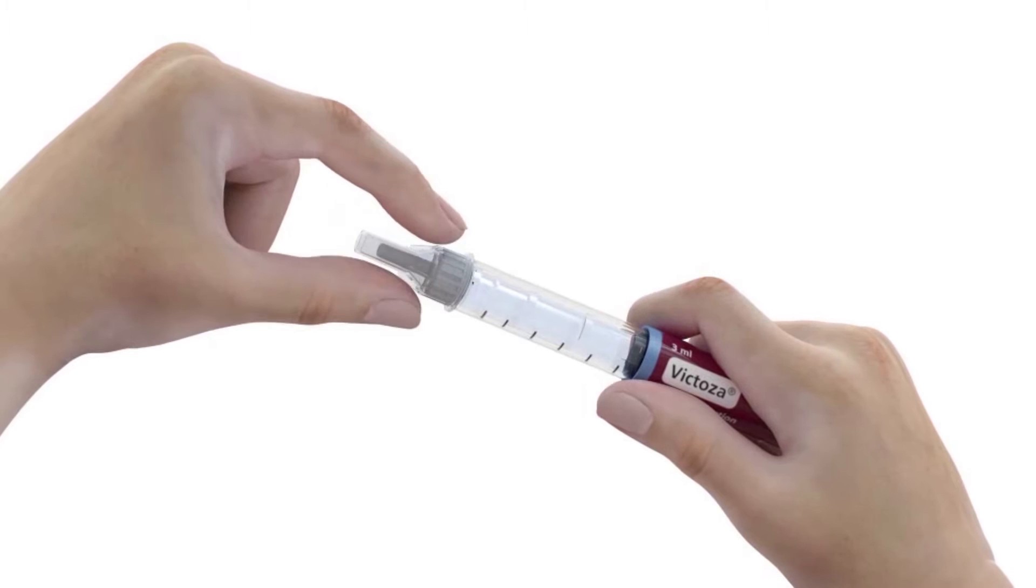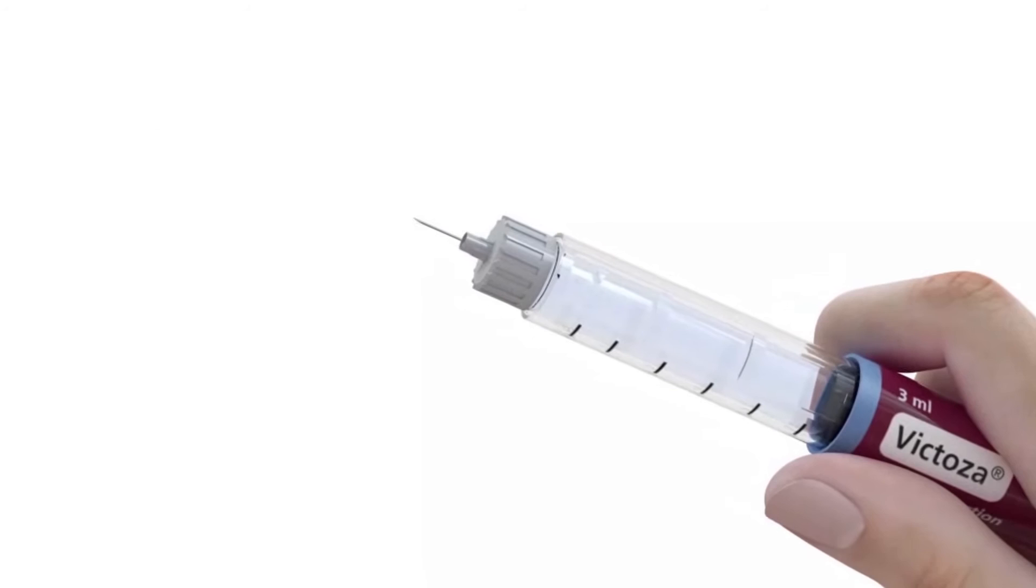To prepare Victoza pen, attach a new needle. If using a Novo Fine needle, screw this straight and tightly onto the pen.